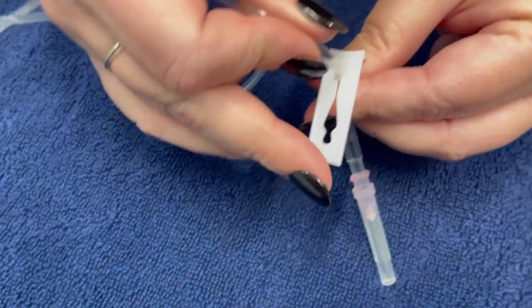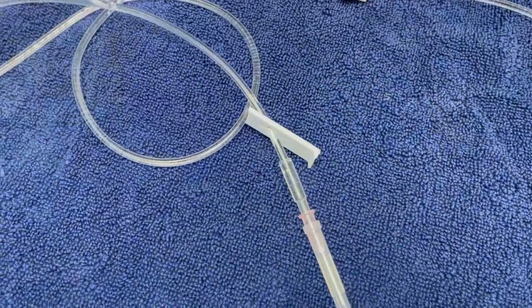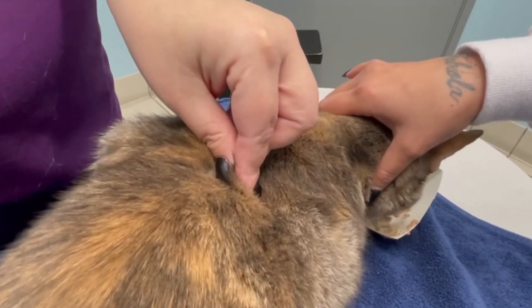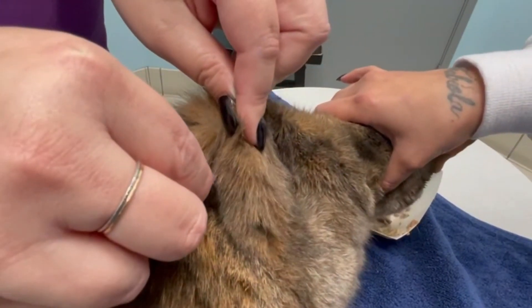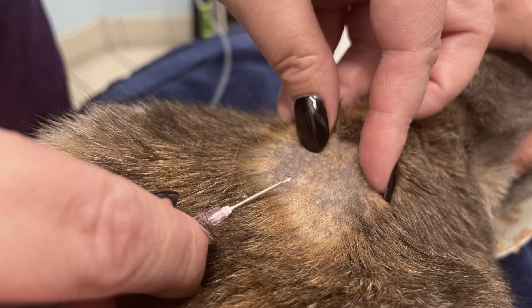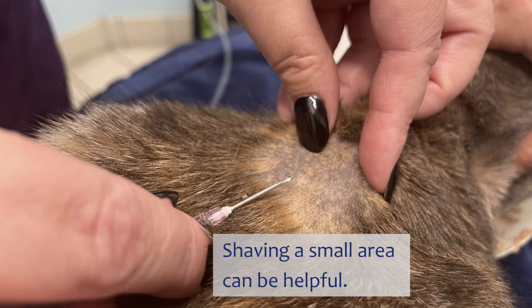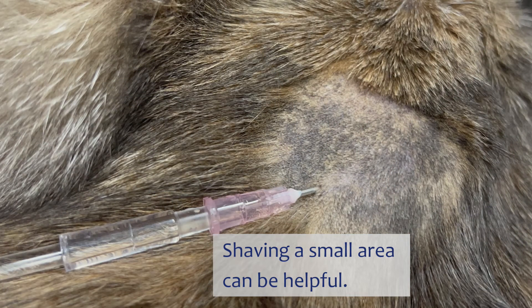When you give the fluids, you can see on the fluid line that there are multiple locks to stop the fluids from going out, so you want to make sure that you have those open. For giving the actual fluids, you want to tent the skin right here in between the shoulder blades — they have a lot of loose skin there to take the extra fluids — and then put the needle in into that tent. Sometimes when you're first starting out, it helps to have a little patch shaved so you can see better what you're doing and where you're giving the fluids. As you get comfortable, you don't need that little patch of fur shaved.